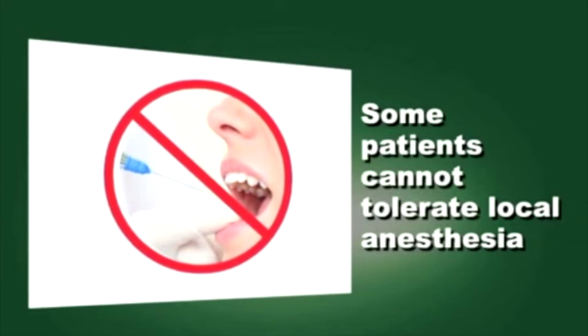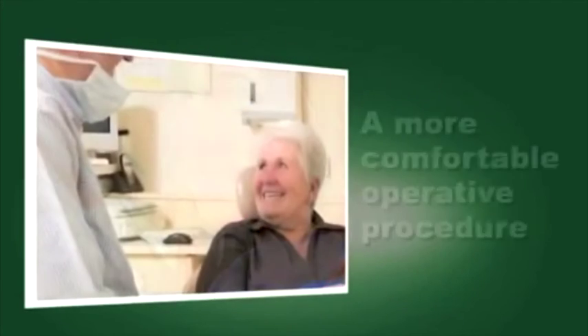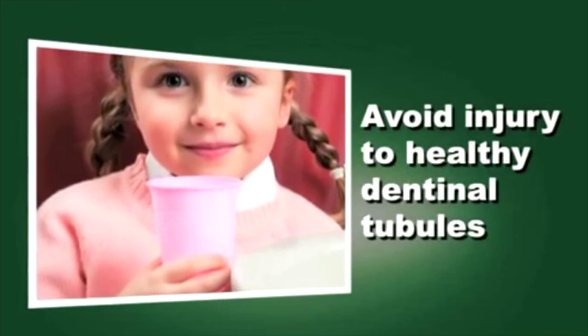Some patients refuse or cannot tolerate local anesthetic injections during caries removal. For these patients, using Smart Burst 2 polymer instruments can help provide a more comfortable operative procedure by avoiding injury to healthy dentinal tubules.